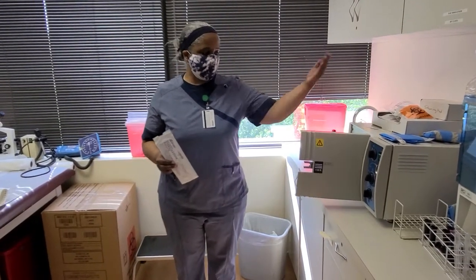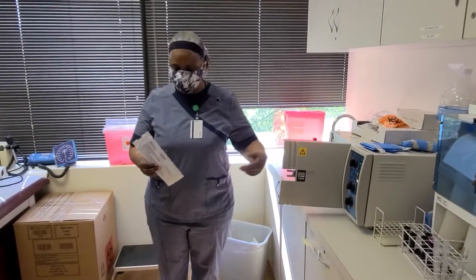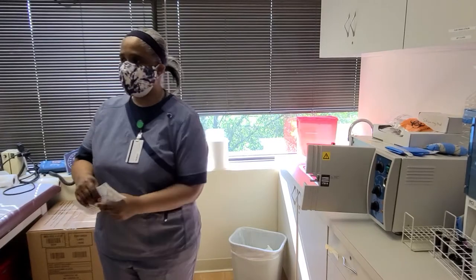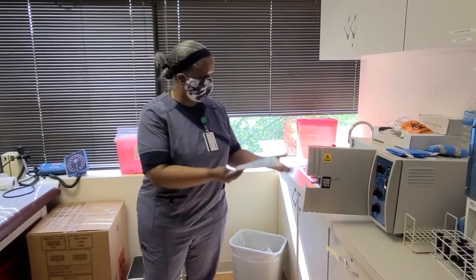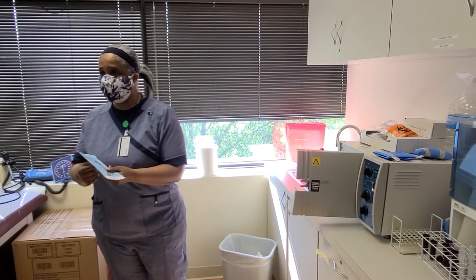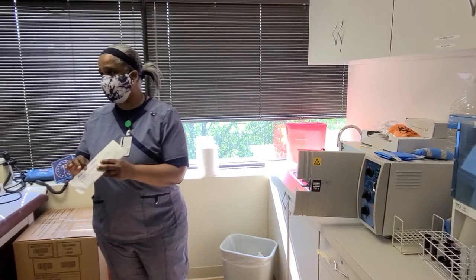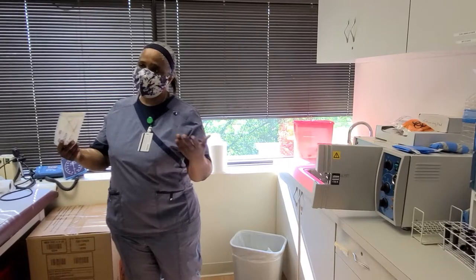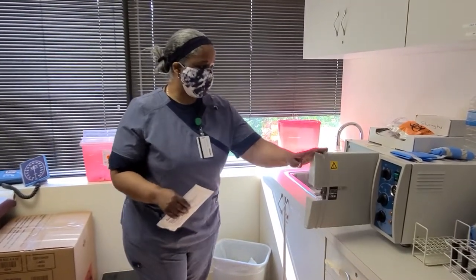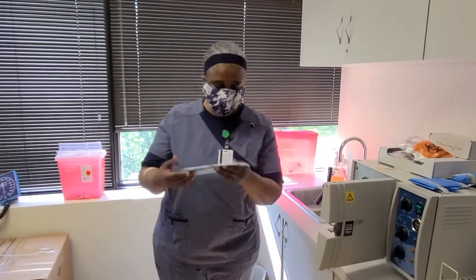I'm going to go through the steps of how we autoclave instruments, but what's important is we want to make sure that we put the plastic side down, not the paper side down. The steam is coming from the bottom, and a lot of the condensation will make the paper wet, and it will tear the paper, and now my instruments are exposed, and I'm going to be wasting everybody's time, okay? So when we place instruments in here, we want to place our instruments face down.